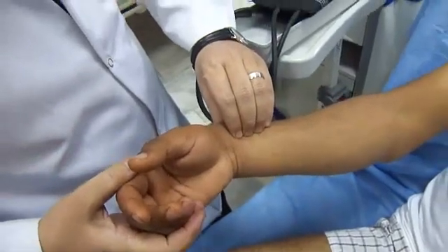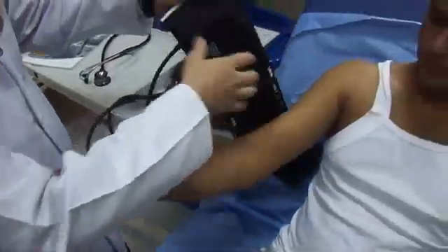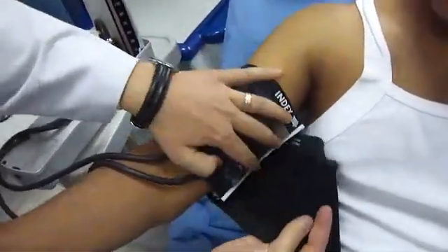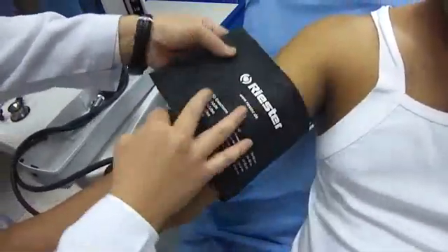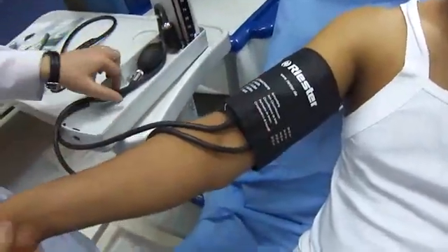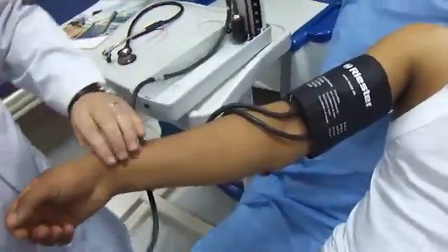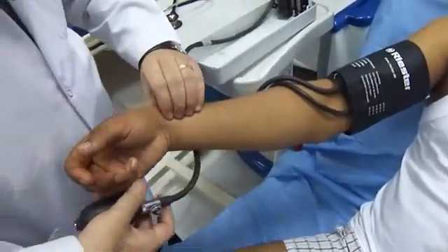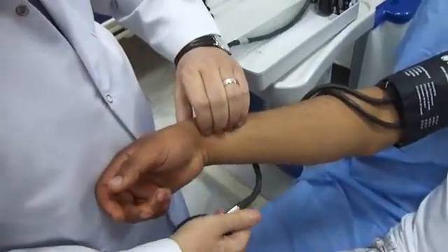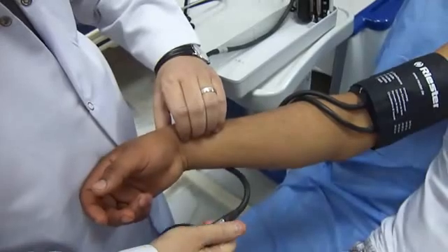I'll uncircle the sphygmomanometer cuff and inflate the blood pressure cuff until the radial pulse becomes impalpable.